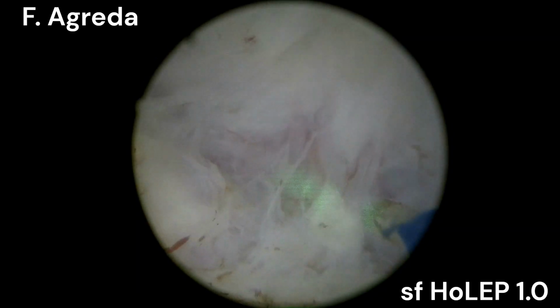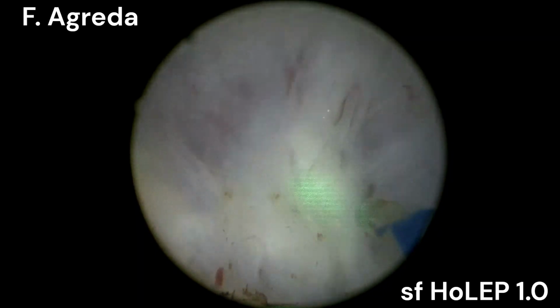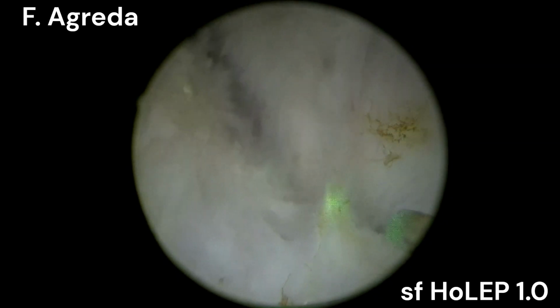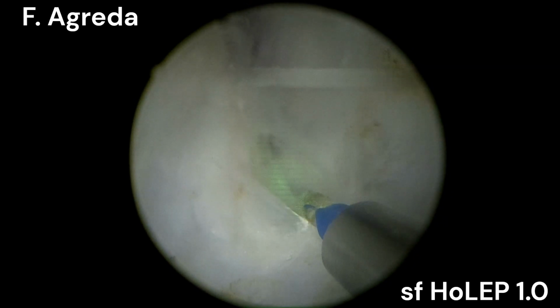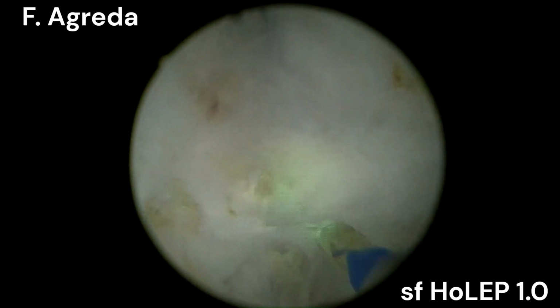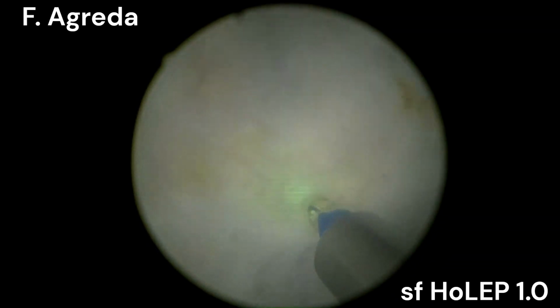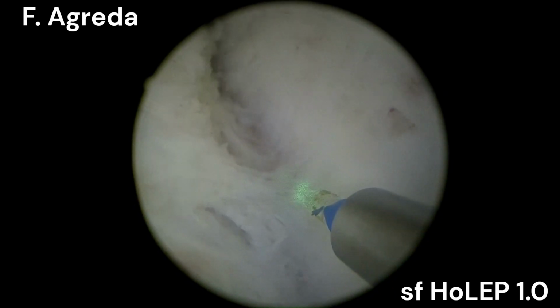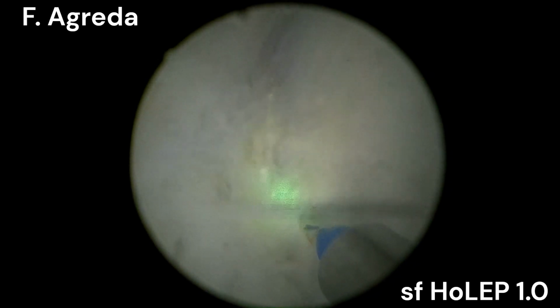As you can see here, it's very nice. When you do it like this, there's almost no bleeding at all, and you can progress in a very controlled, very nice way. You can see every structure you're dealing with, and you can do a very nice dissection with almost no risk of considerable loss of blood, or doing a prostate capsule perforation.